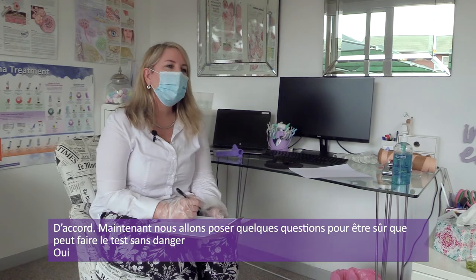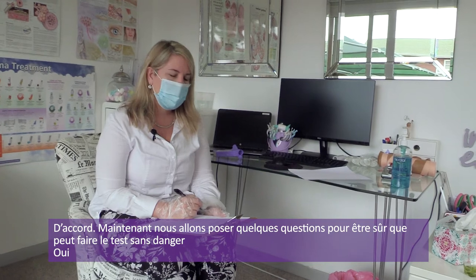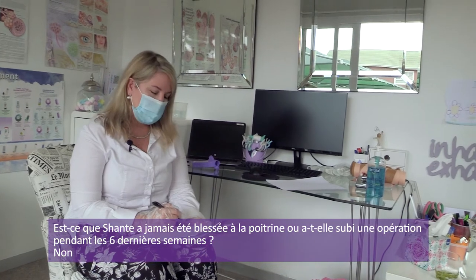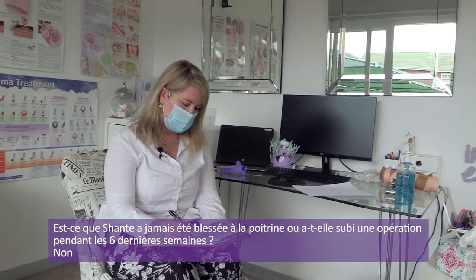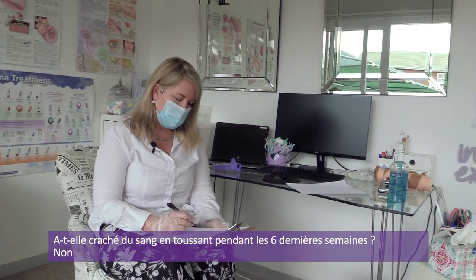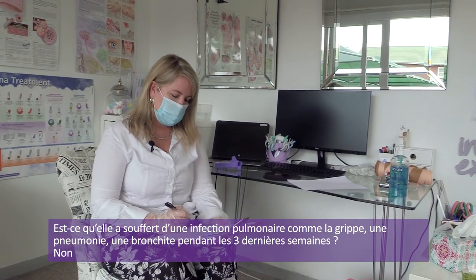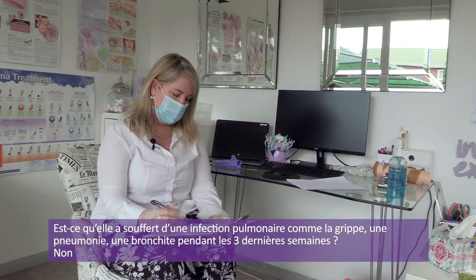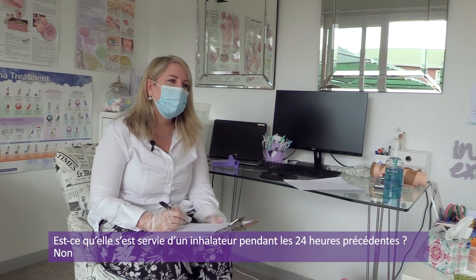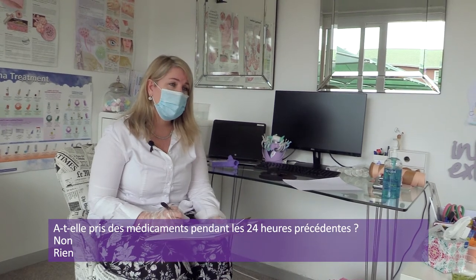All right, good. So now what we're going to do is just ask a few questions to make sure that it's safe for Shanti to blow. Yes. All right. Has Shanti ever had any injury to her chest or any operations in the last 6 weeks? No. Has she been admitted to hospital in the last 6 weeks? No. Has she coughed up blood in the last 6 weeks? No. Has she had any respiratory chest infections such as flu or pneumonia or bronchitis in the last 3 weeks? No. Has she used an inhaler in the last 24 hours? No.